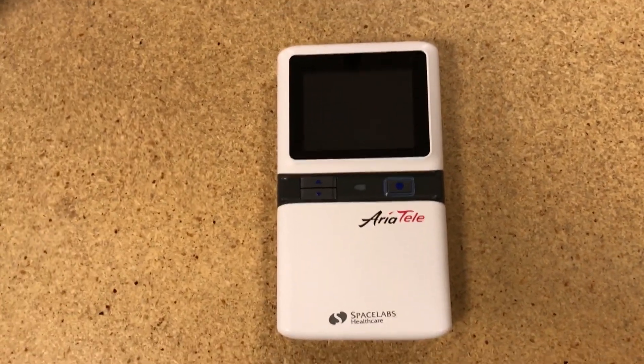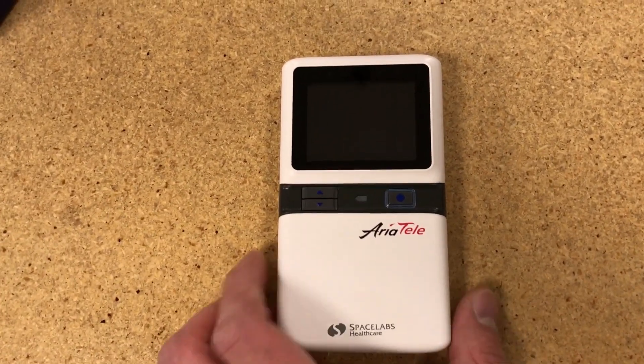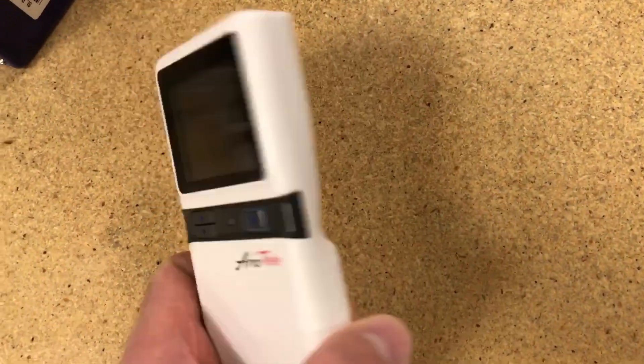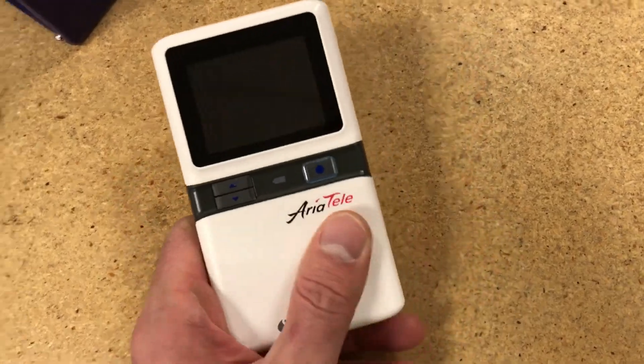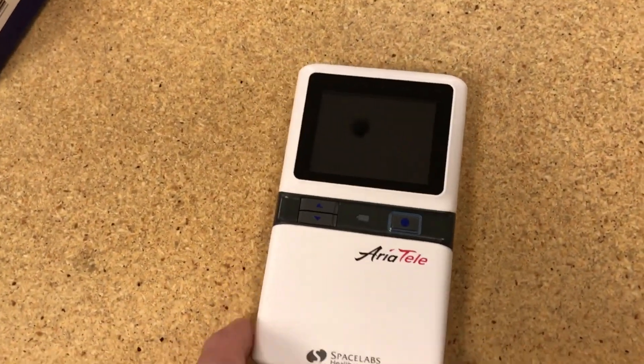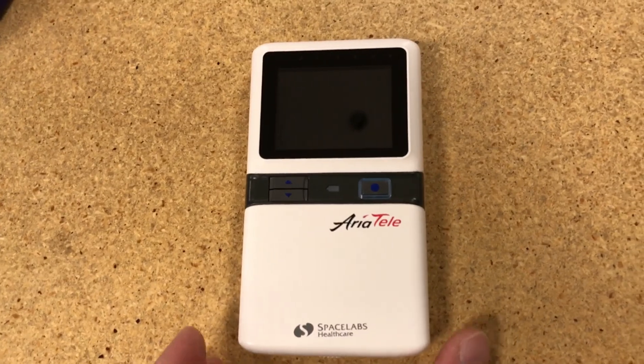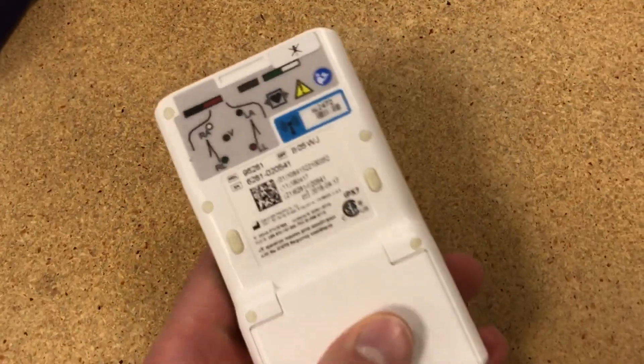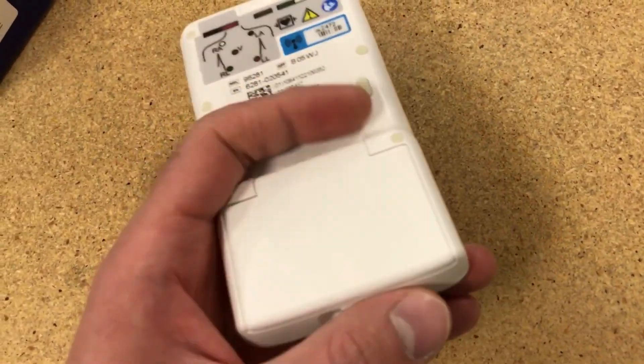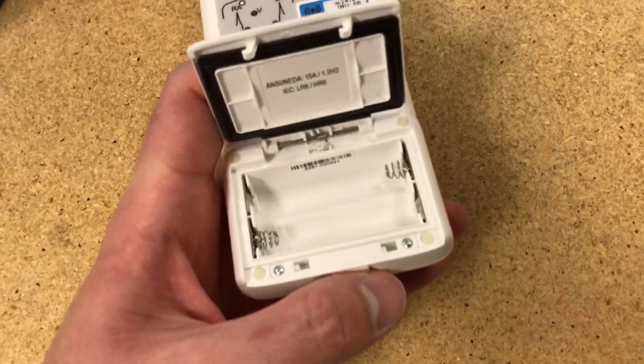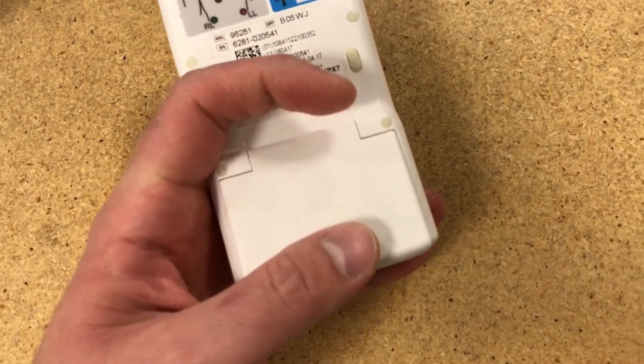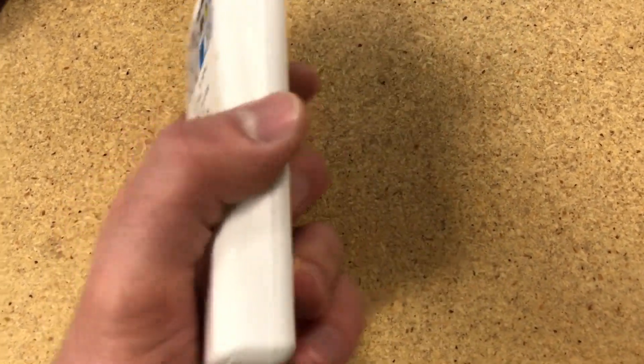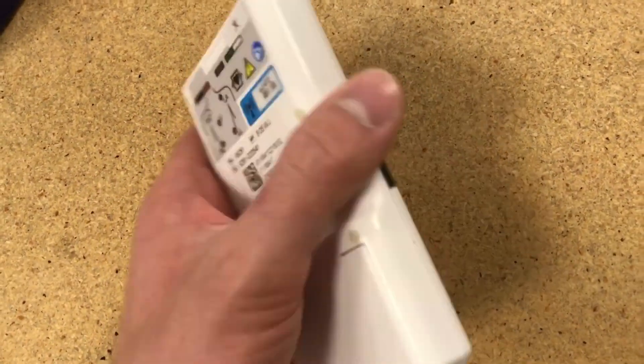In this video, I wanted to go over these transmitting units, the portables, which can be used as an alternative to the other ECGs over there. A couple things to note about them. Firstly, they use two AA batteries. There is no power switch on these. As soon as you put the batteries in, they start transmitting.